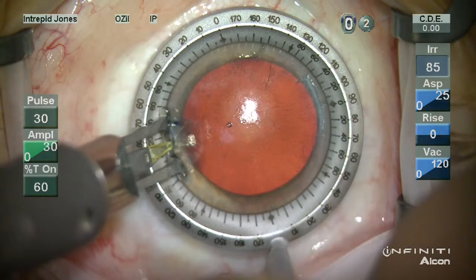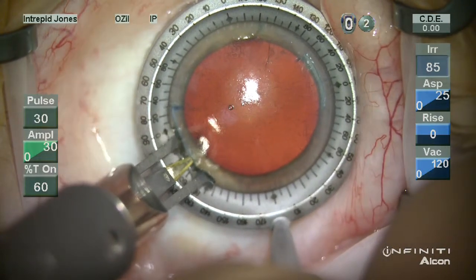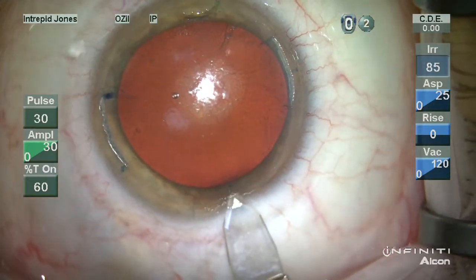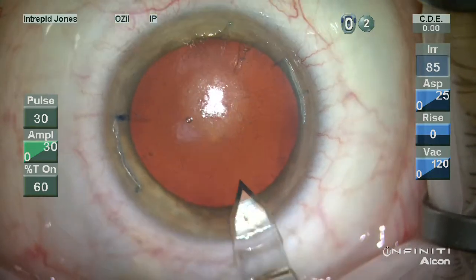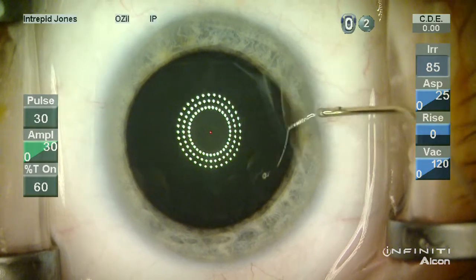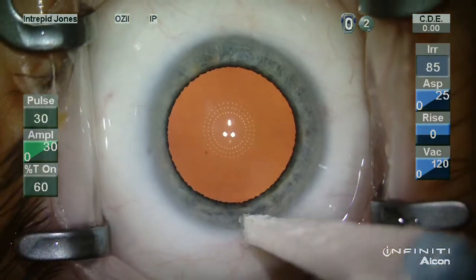On this side here, you can see that I'm once again incising towards me. I've not quite followed the arc of this ring device, which can be very helpful. So I've just relaxed my grip and continued on. Paracentesis and main wound are then fashioned in a routine manner, making sure that we use the reference mark for the main wound. In this case here, you can see that I have an intraoperative illuminating keratoscope. This is also from Mastel, and it can be used as a helpful guide intraoperatively. Notice the oval orientation of the marks of the keratoscope.